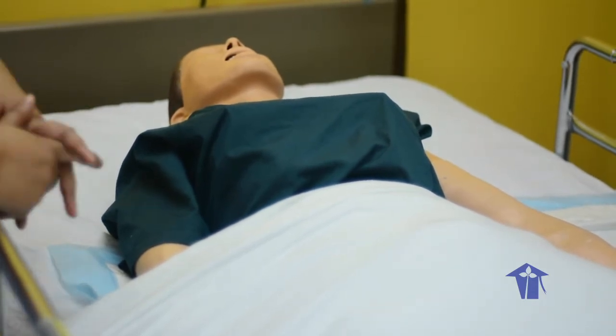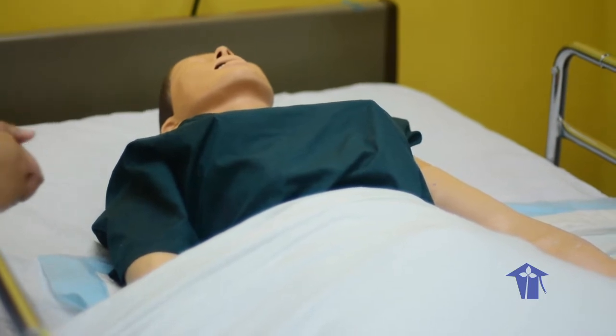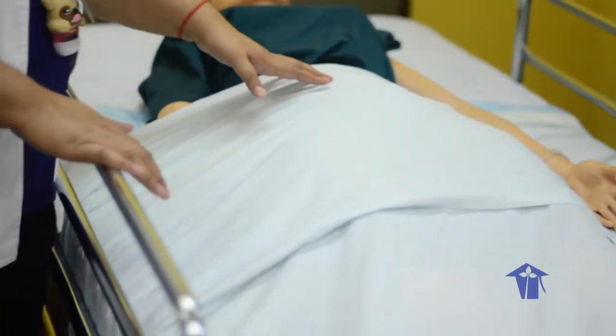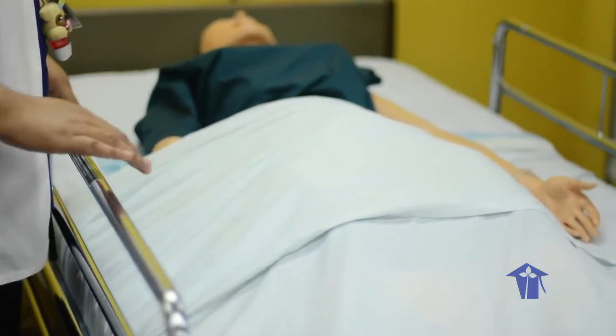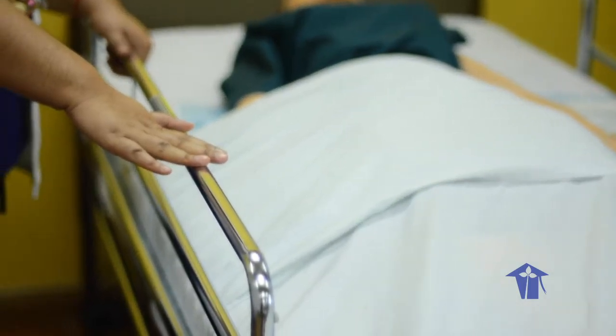Great. So we are going to turn you to change your sheets. Is that okay with you? Yeah, that's fine. All right, good. So in every bed, once the patient is in the bed, normally you would have your side rails put up. So if we are going to make the beds, I'm going to put my side rails down, all right?